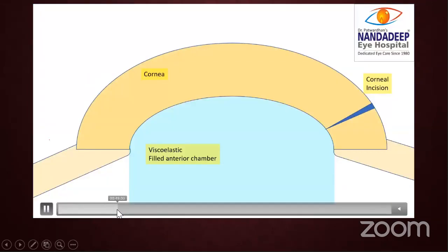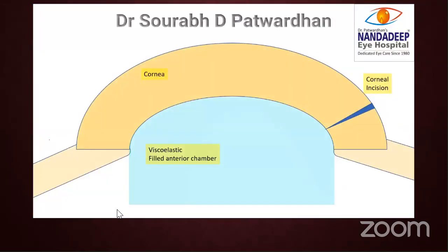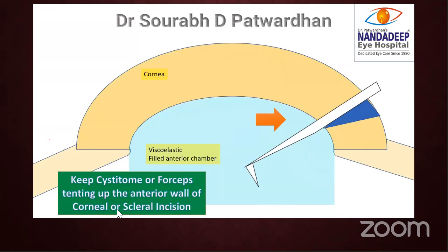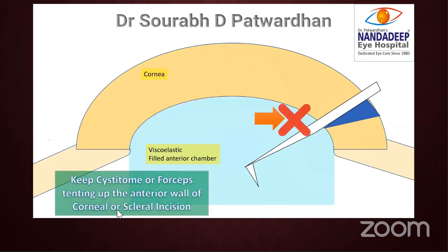So if you see the cornea and the incision that we have made, this incision is self-sealing because whenever there is increased pressure from inside on the posterior lip, it seals itself. So when any instrument, cystitome or forceps, is inserted inside, and when you are pulling the anterior lip upward, it prevents leak of visco or fluid from the anterior chamber, because here the fluid will be pressing the posterior lip up, and that's why the wound remains sealed.